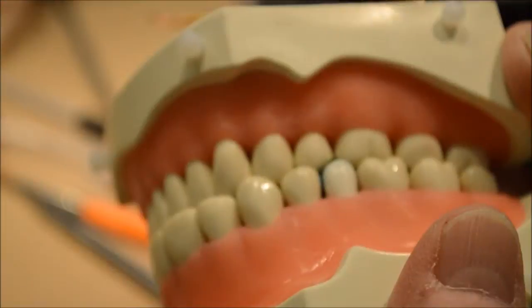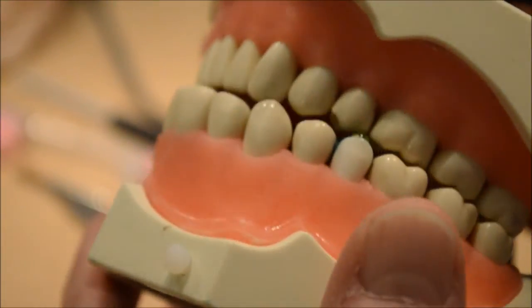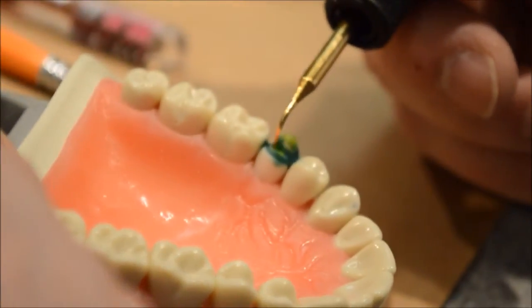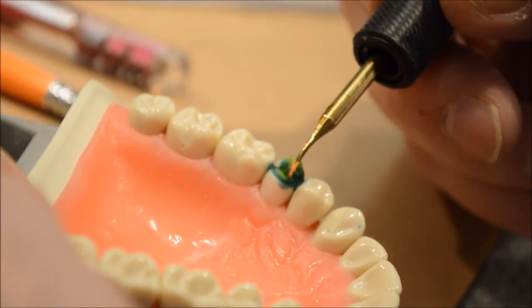We'll try it again — see, that's right there in the middle, so we know it's okay. We're going to leave that like it is. Now we've got to put one on the lingual — lingual is this side.